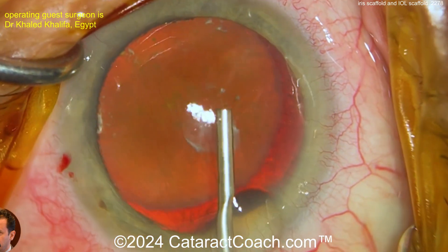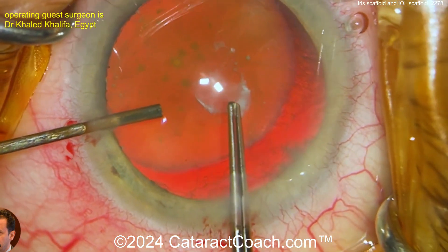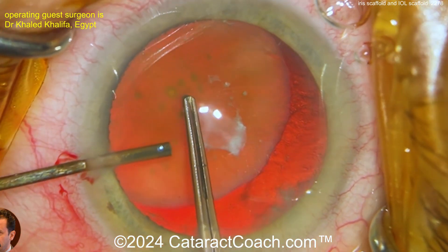So there's the nucleus — you can see it's very much displaced. Wow, a lot of iris loss here. It's going to be really tough to get a rhexis done, but you can try.